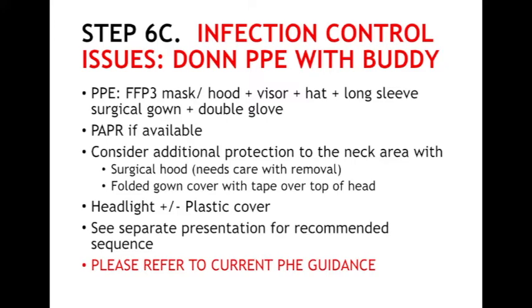We have identified that during the procedure, the operating team will have a deficiency of the standard protection in the neck area, and to minimise this, additional use of a surgical hood or a folded gown cover can be used to reduce exposure of bare skin to potential virus aerosol.